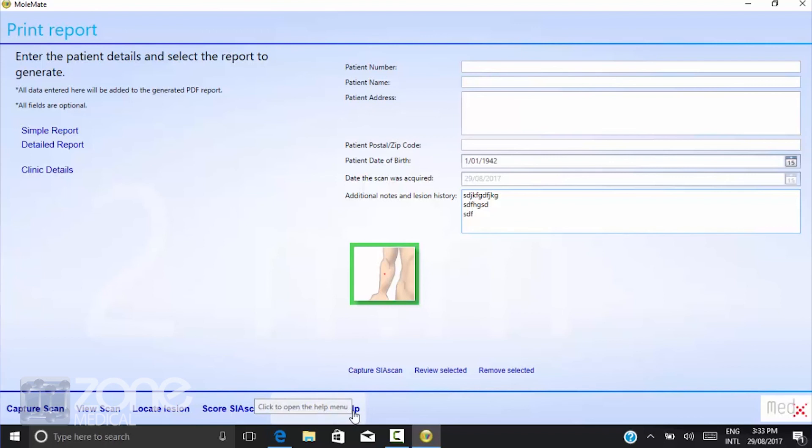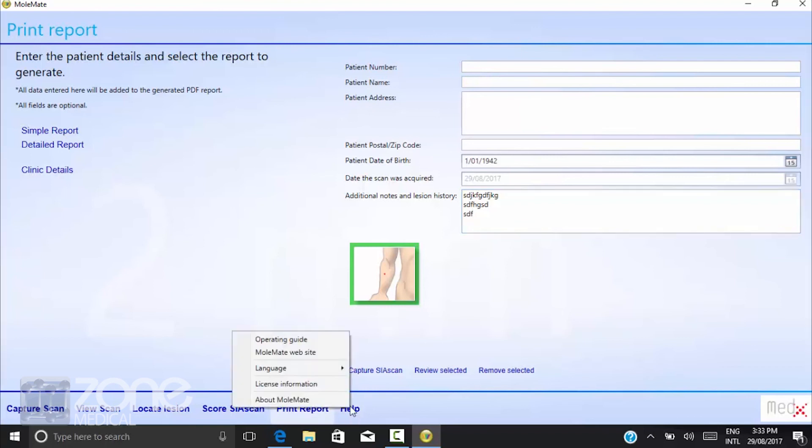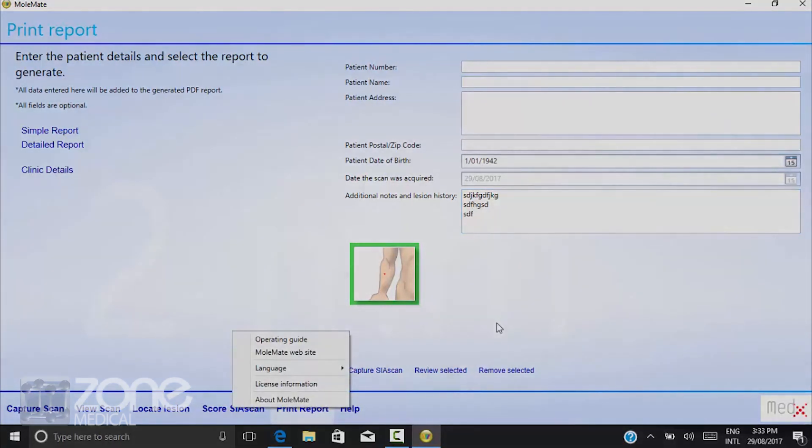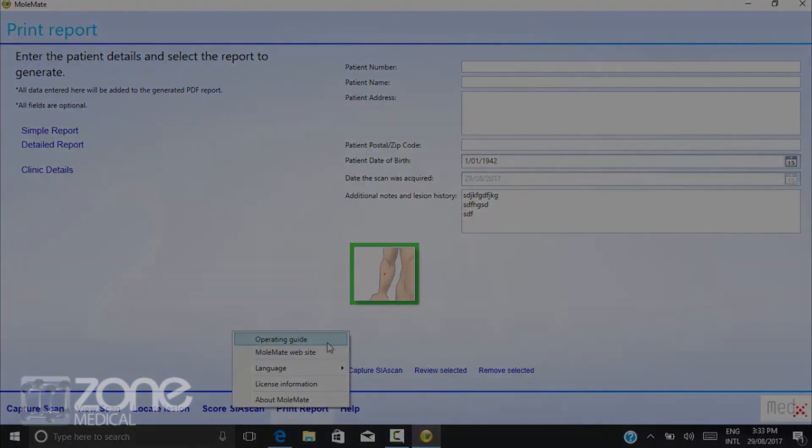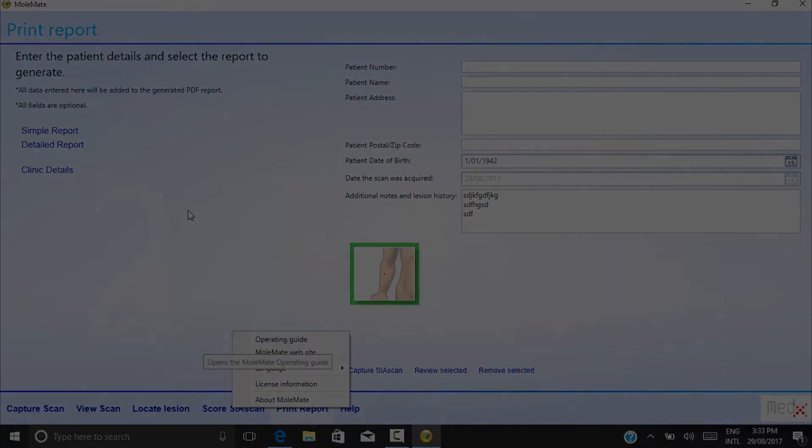And that is a very basic run-through of the MoleMate software. If you have any further queries, please contact the Zone Medical Office. Thank you.